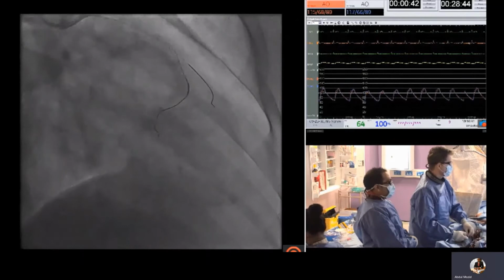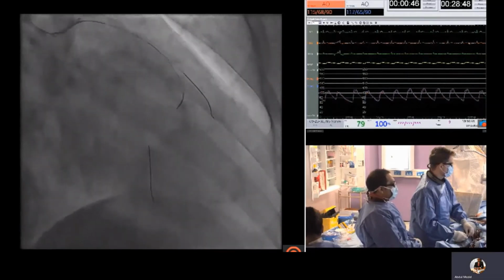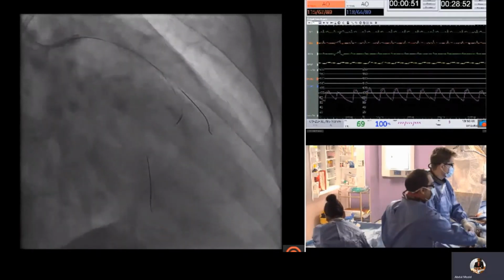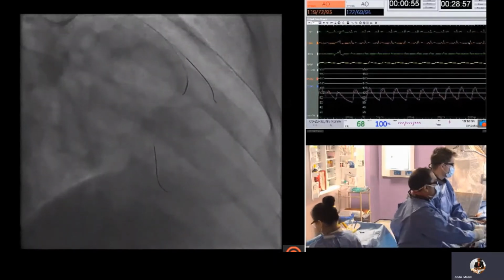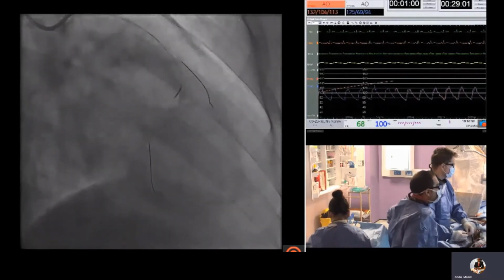And this is a case of doing septal surfing, trying to see if we can cross. We often try septal surfing first, so blind surfing to see if there are any connections. If this proves difficult, then you can move on to performing a tip injection.